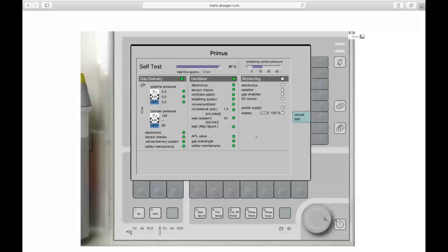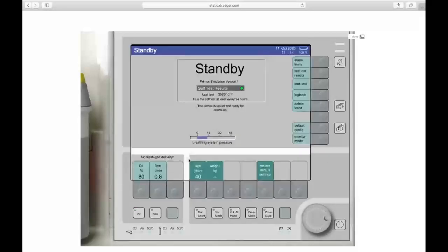After the auto test is completed, you will see the start screen. We should begin by entering the patient age. This is done by clicking the button below the square and selecting the age. Let's say our patient is 53 years old, and confirm. After selecting the age, press the knob again to confirm the selection. This knob feature, which can be rotated and pressed, is quite common in all mechanical ventilation and anesthesia devices.